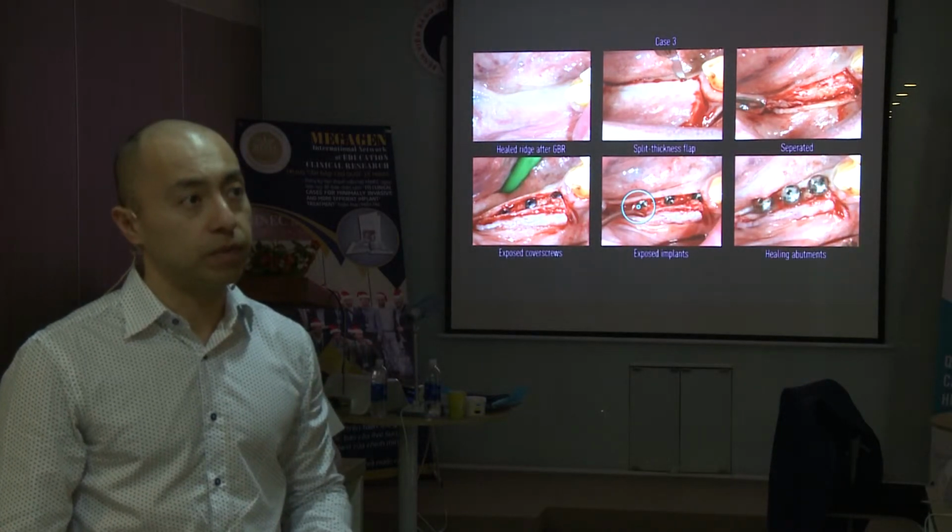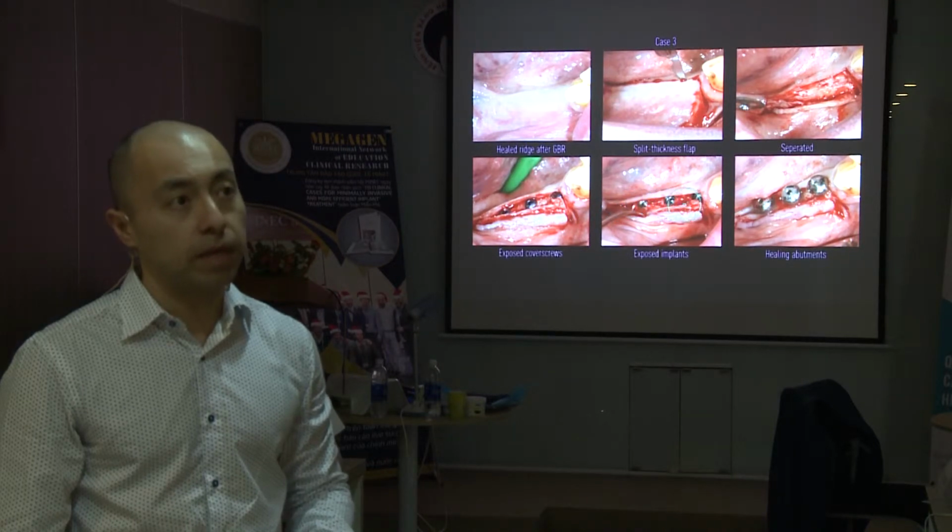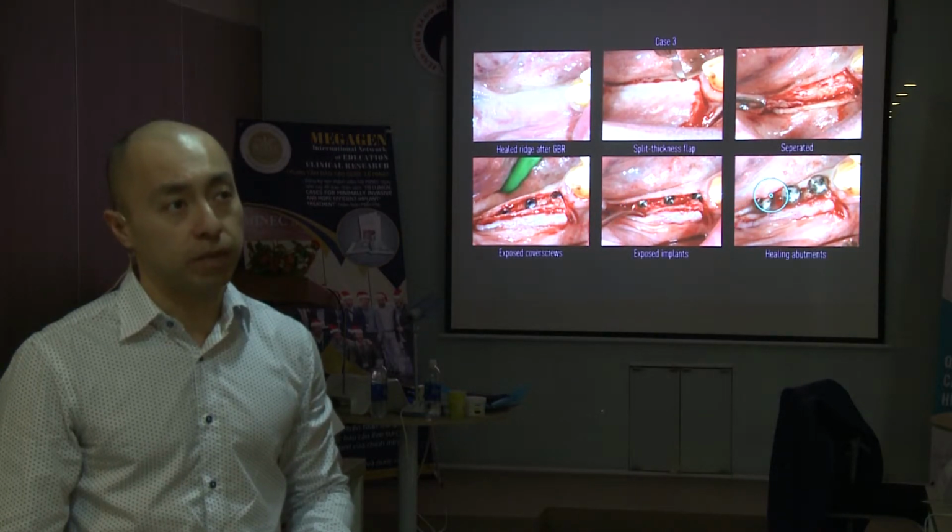Here are my implants exposed. You see, they're fully exposed. And then I place my healing abutments.